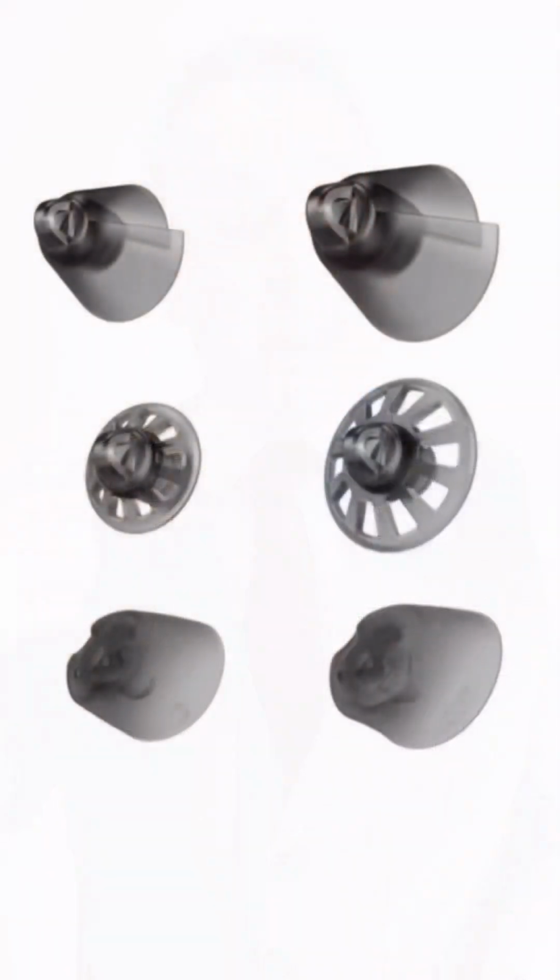Number 2, if you are swapping from an aid with a soft silicone dome like a receiver in the canal aid or a thin tube model, there can certainly be a bit more of an awareness of having something in your ear when you're wearing a traditional CIC aid. With the Silk 7 C&G IX mainly being fitted with domes and sleeves, the physical comfort of the aid is likely to be a lot more acceptable, especially when you are first getting used to the aids.